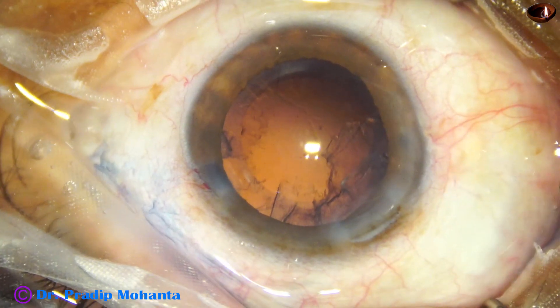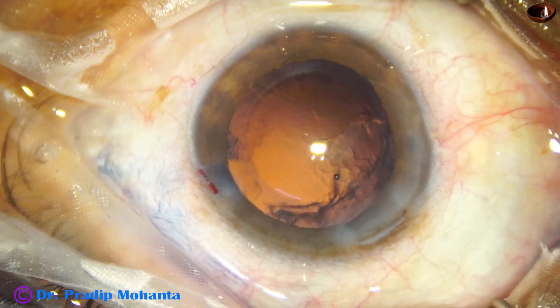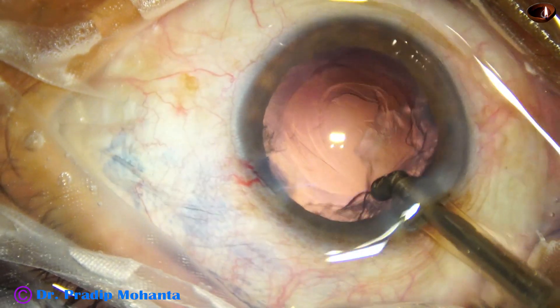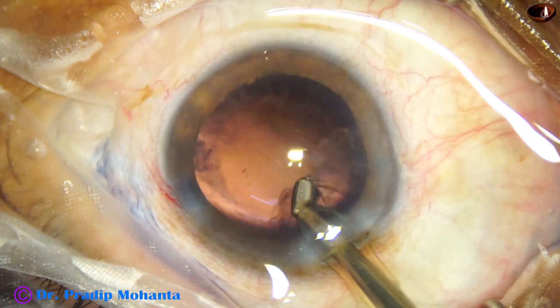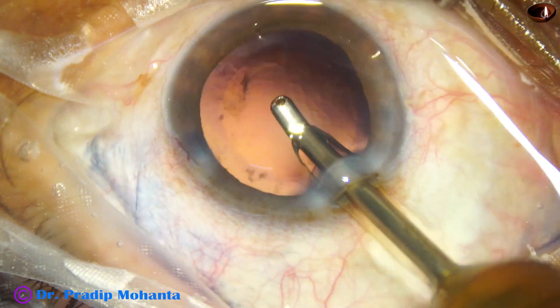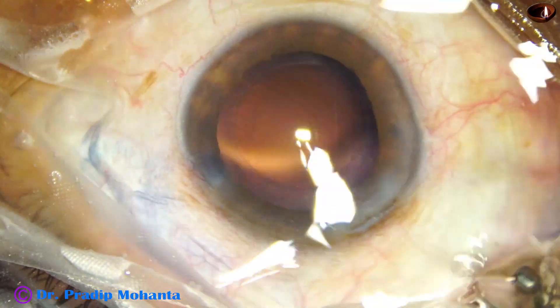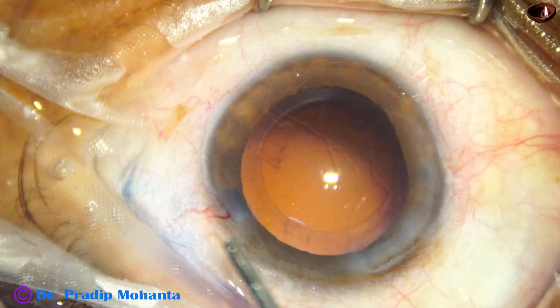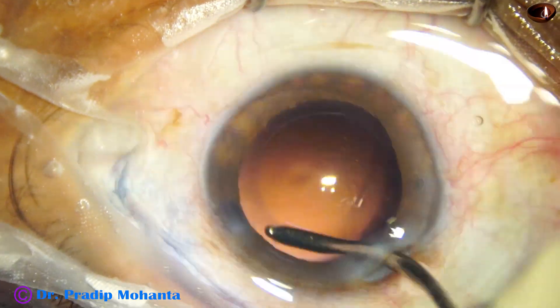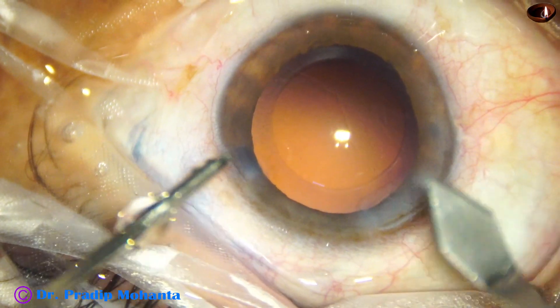Emulsification of the pieces is carried out. A part of the cortex has been removed by the phaco needle itself; hence, the rest of the cortex is being removed by coaxial irrigation-aspiration. The machine used is Oertli from Switzerland — no financial interest, just for your information. Cortical cleanup has been done, and this is hydro polish, where debris attached to the posterior capsule is dislodged by the irrigating jet of fluid.